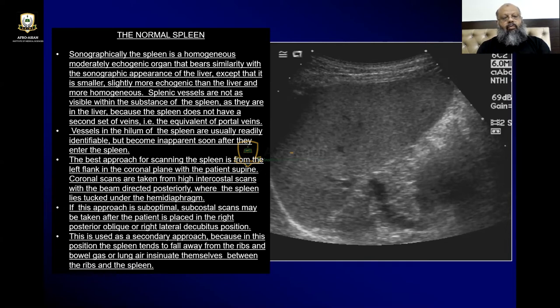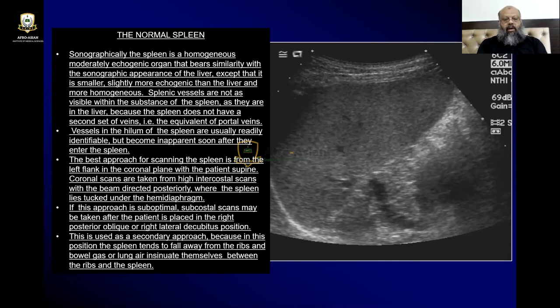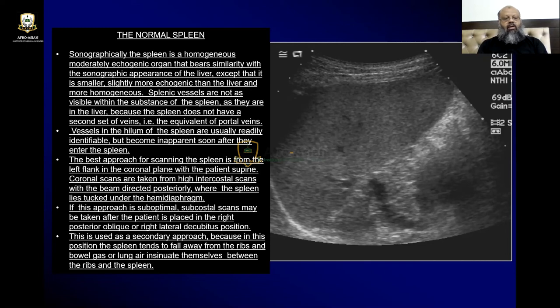The best approach for scanning the spleen is from the left flank in the coronal plane, with the patient lying supine. Coronal scans are taken from high intercostal positions with the beam directed posteriorly, where the spleen lies tucked under the diaphragm. If this approach is suboptimal, subcostal scans may be taken after the patient is placed in the right posterior oblique or right lateral decubitus position.